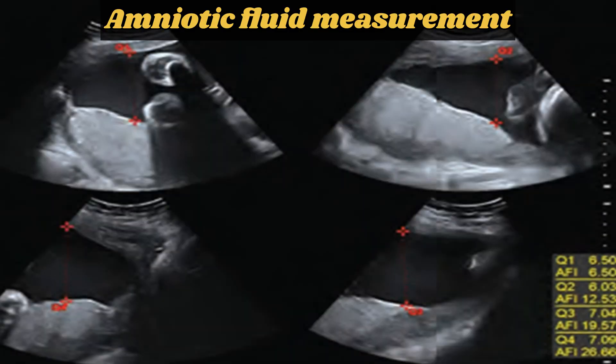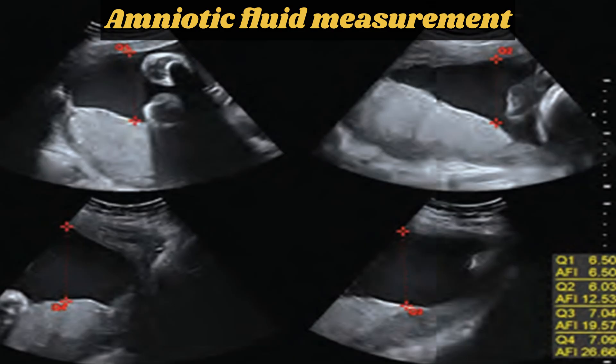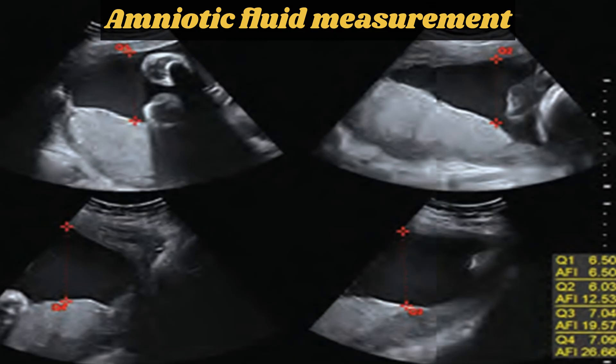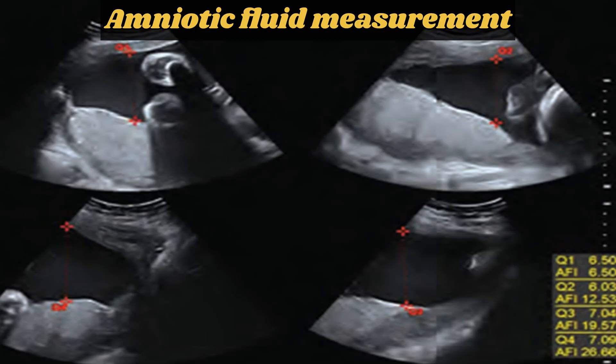First, we are going to discuss the amniotic fluid volume. The amniotic fluid index (AFI) is obtained by dividing the gravid uterus into four quadrants, measuring the deepest fluid pocket without fetal parts or the umbilical cord in each quadrant, and adding the four measurements together. An AFI of less than 5 to 8 cm diagnoses oligohydramnios, and greater than 24 cm diagnoses polyhydramnios.